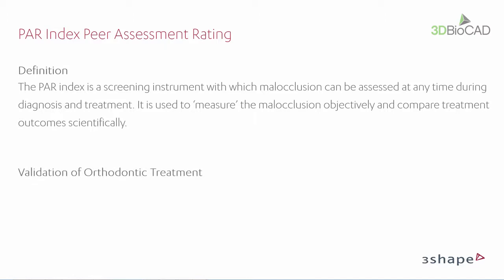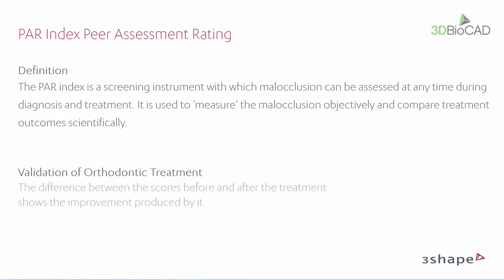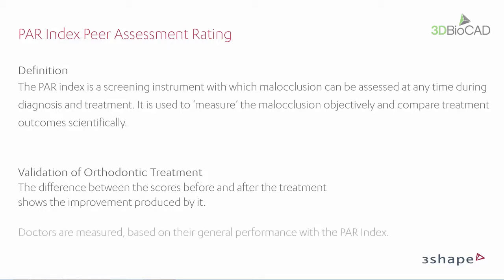The PARIndex is used for validation of orthodontic treatments in two ways. Firstly, the difference between the scores before and after the orthodontic treatment shows the improvement produced by it. Secondly, doctors are measured based on their general performance with the PARIndex.